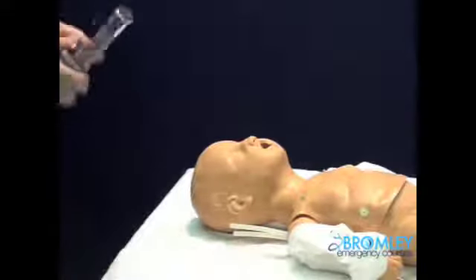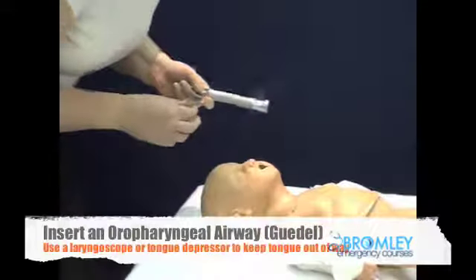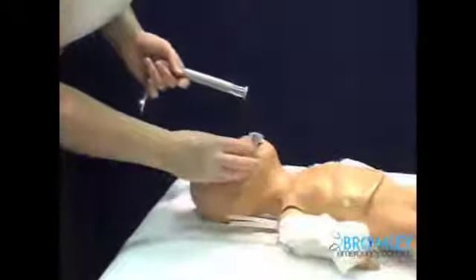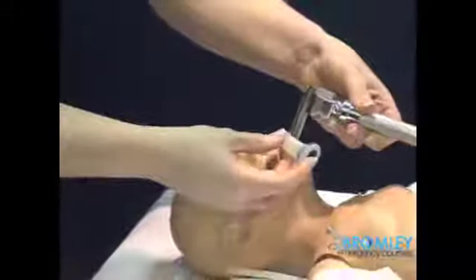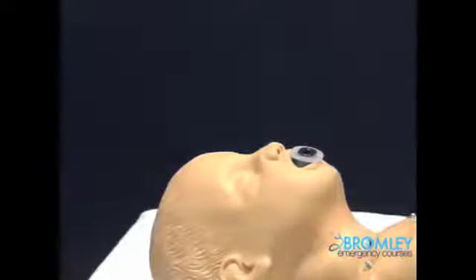A Guedel airway, which would be sized in a similar way to how we size it in adults, so from where the incisors would be to the angle of the mandible. Sometimes useful to use something to depress the tongue when inserting the Guedel, which is not inserted upside down as in adults, but forward. And then we would apply supplemental oxygen when that is in place.